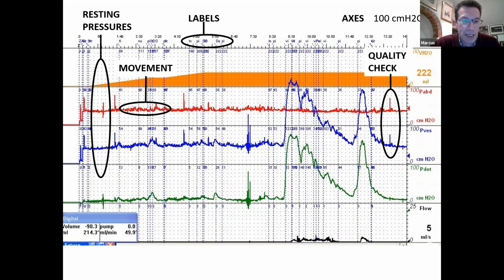Just straight after we start recording from the patient, if I could get my arrow to appear on my laptop, here it is. You see a little jump here and a further jump here as we go between zero to atmosphere and full recording from the patient. Would anybody like to suggest why there is an additional leap here when we switch from recording to atmosphere to recording to patient? Any thoughts on that?